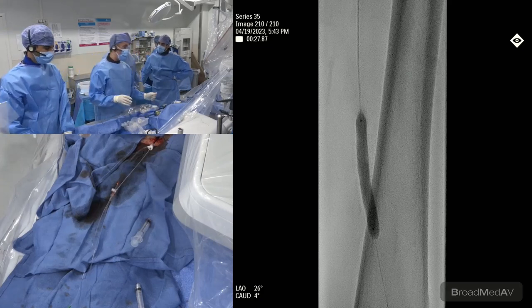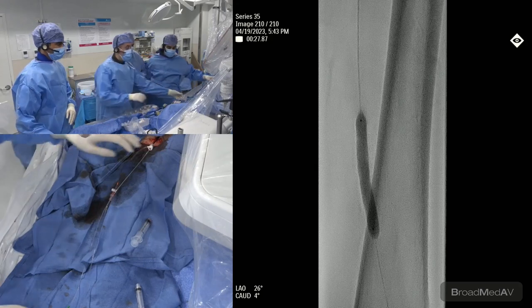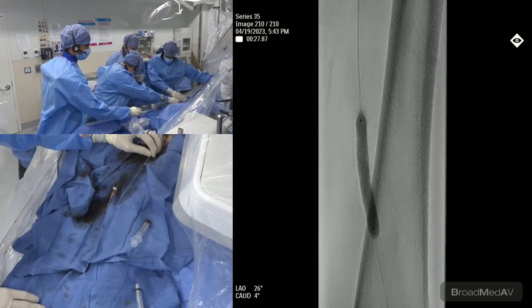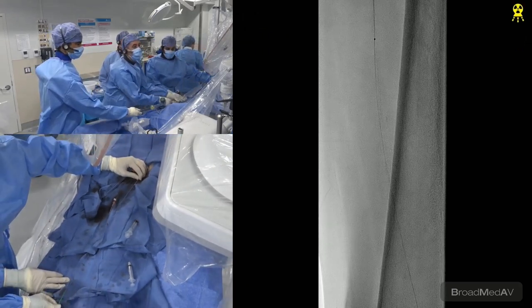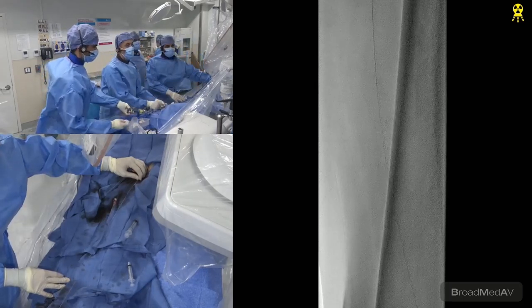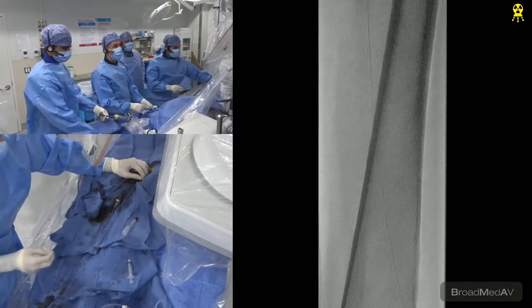I asked that because, as we were talking about the data gathered from the IVUS, that proximal segment, the majority of the lumen was almost 2.5 millimeters. It's quite small. So would you feel comfortable leaving that? I would, because at the end you just want a gradient, right? The highest gradient was here.